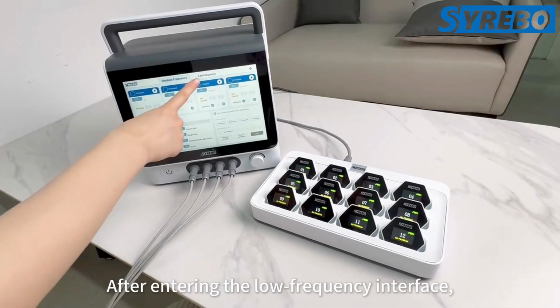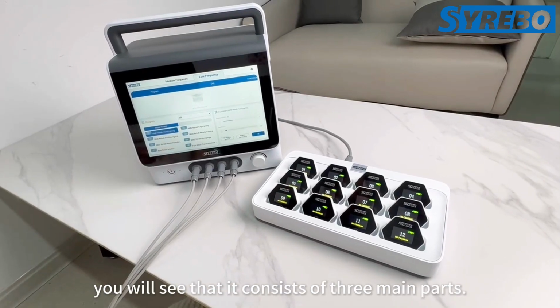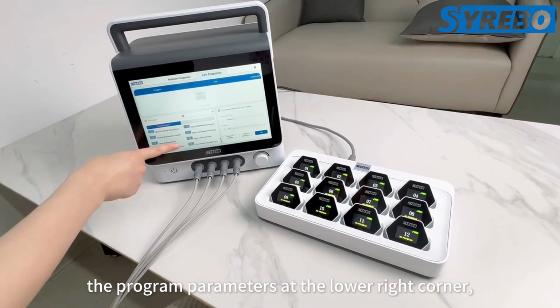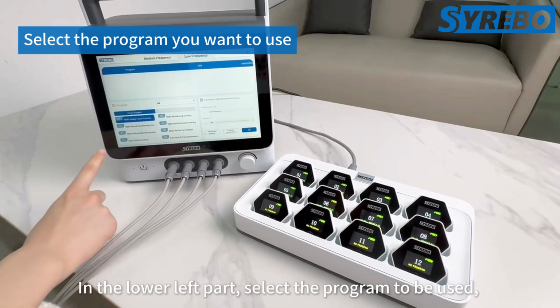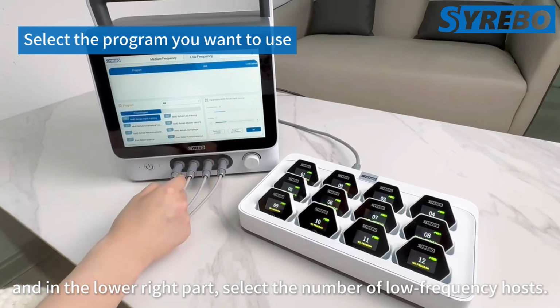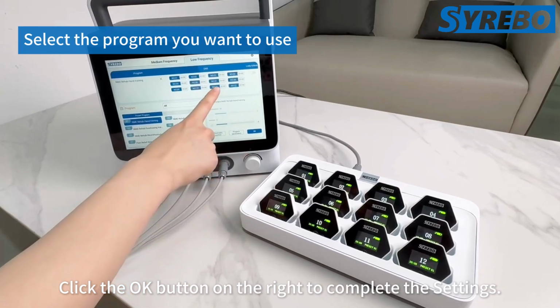After entering the low-frequency interface, you will see that it consists of 3 main parts. The program name is displayed at the lower left corner. The program parameters at the lower right corner. In the lower left part, select the program to be used, and in the lower right part, select the number of low-frequency hosts. Click the OK button on the right to complete the settings.